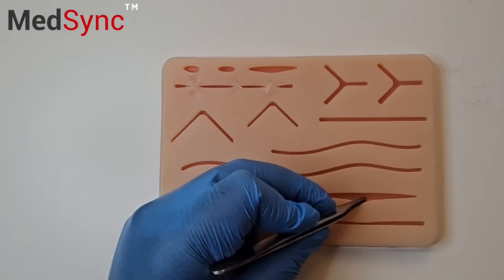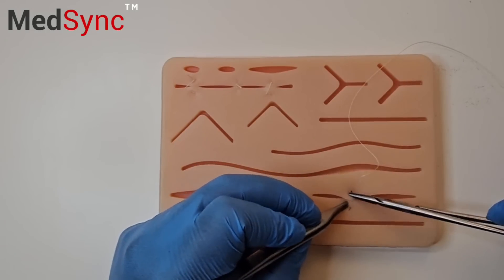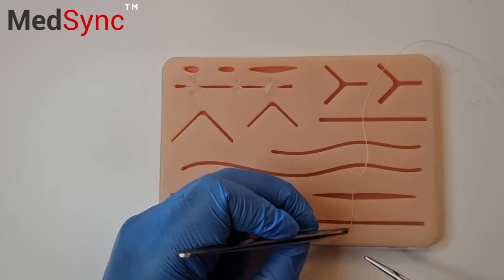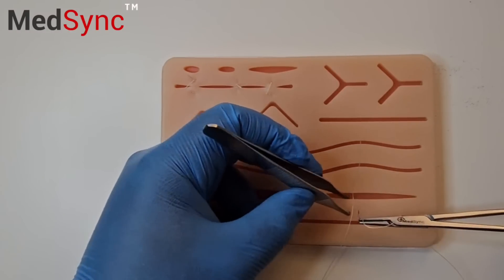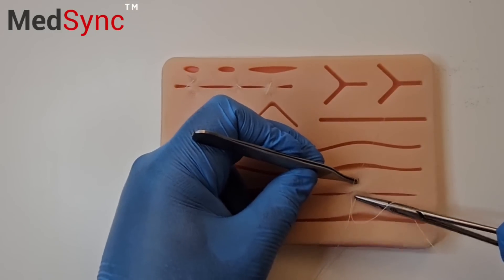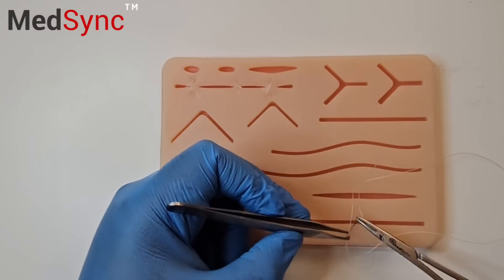Sometimes your wound edges are just further apart and you need to do a quick stitch. You can do a locking horizontal mattress. You turn the needle around, you go in next to where you came out, you come out next to where you came in, but this time you put the needle through the loop.